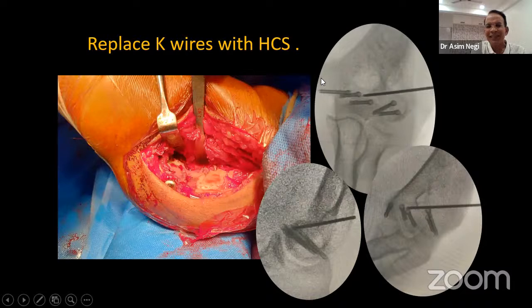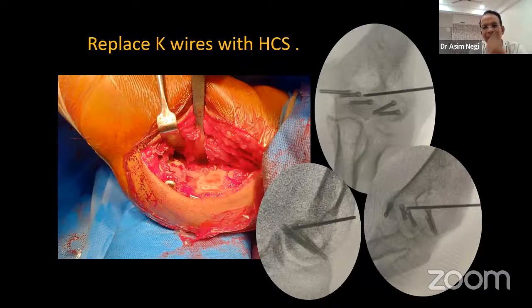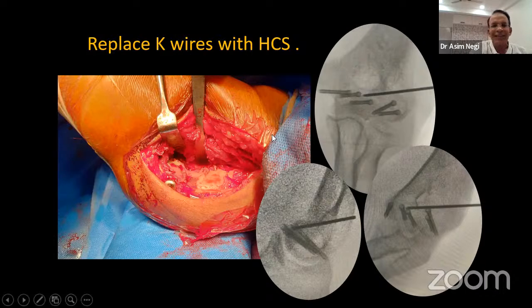Once you flex the elbow, you can see more medially. So constantly somebody is flexing and extending the elbow. You have to strike a balance. You don't need to go more medial than this. There are 5 of them.